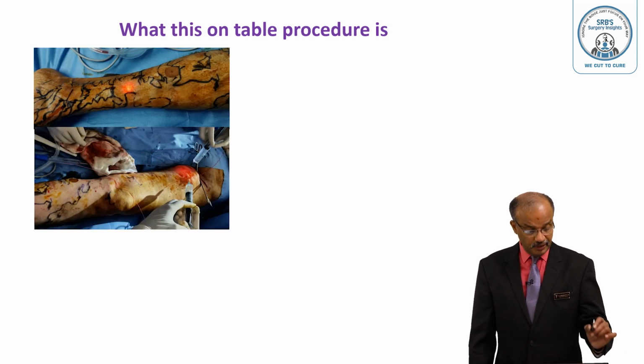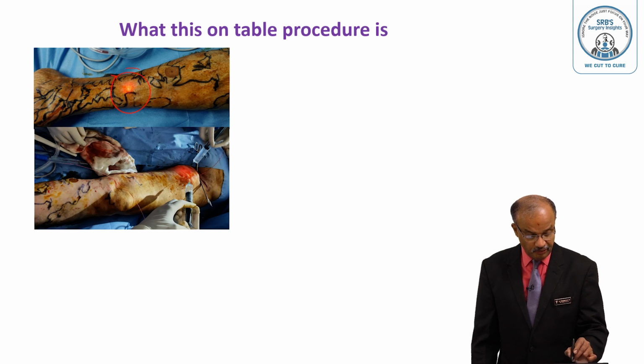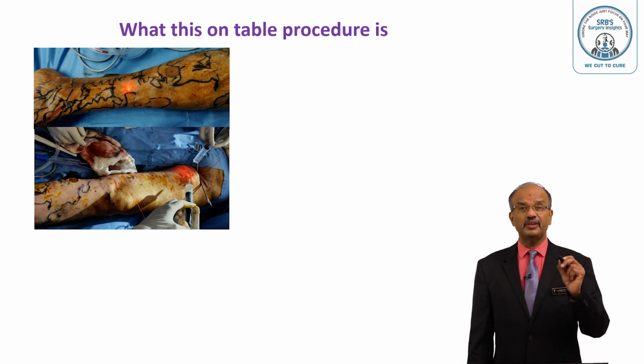Look at that. See here, you can see the glow. It's very, very typical. See that? Here also you can see the glow. Somebody is injecting something here. You can see the fiber, some fiber running here. So this very typical thing is endovenous laser therapy.